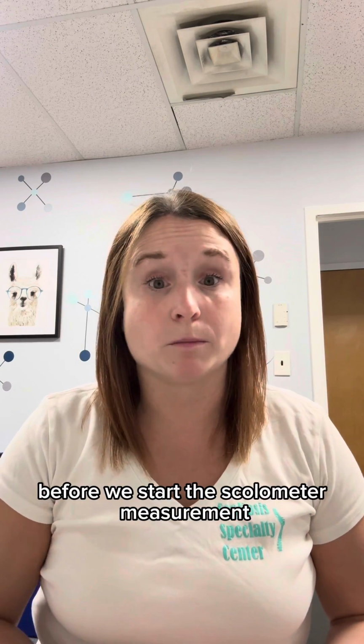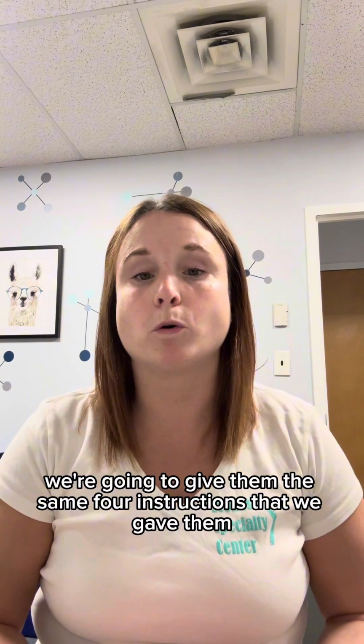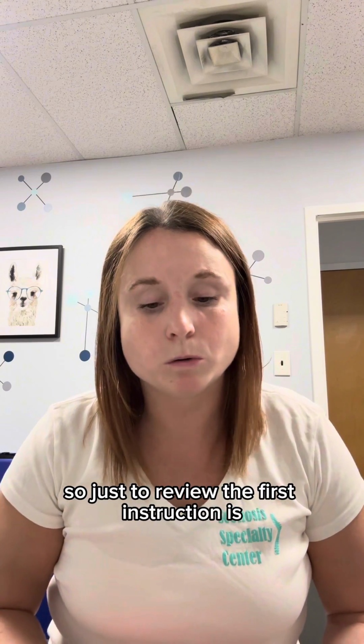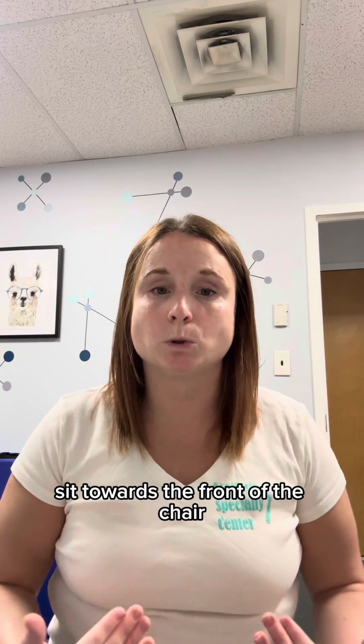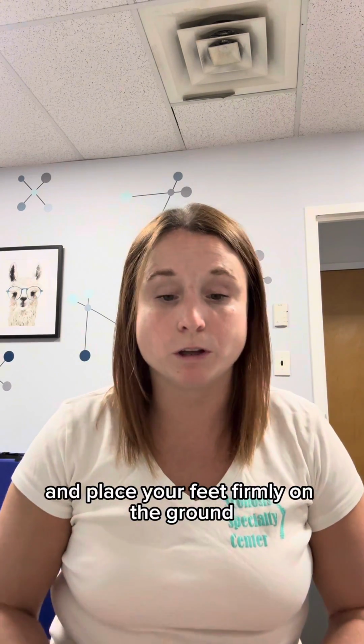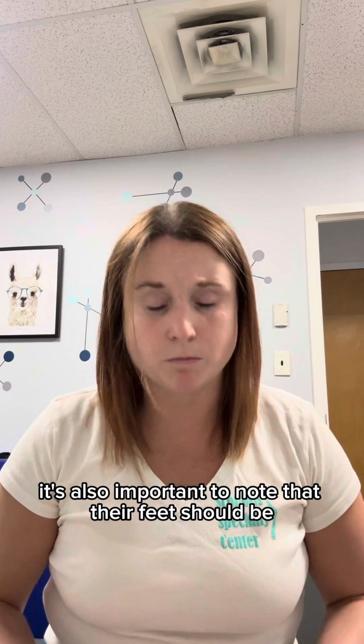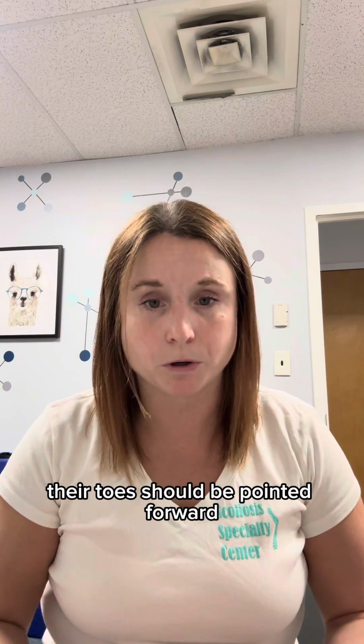Before we start the scoliometer measurement, we're going to give them the same 4 instructions that we gave them for the Adams forward bend test. So just to review, the first instruction is sit towards the front of the chair and place your feet firmly on the ground with your feet hip width apart. It's also important to note that their toes should be pointed forward.